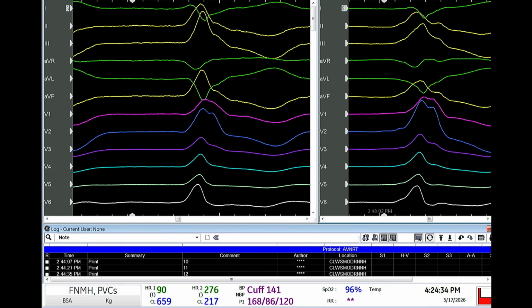In the EKG, they look more impressive. So for me, the first rule for this type of situation is right bundle, no transition. It's one of the rules in EKG for me. When you have right bundle, no transition, you have to be very basal on the left ventricle, okay? So you could argue that this is basal left ventricle from the endocardium. This could be LV summit.